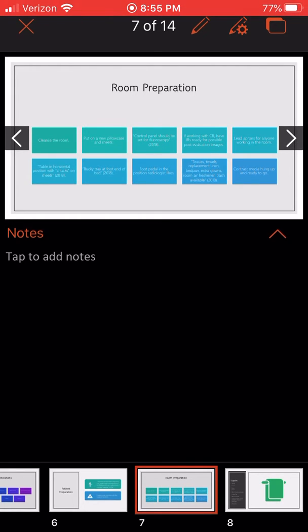The table should be in a horizontal position with chucks on top of the sheets in case of pre-evacuation of the contrast media. The Bucky tray should also be at the foot end of the bed so it does not be in the way of the anatomy. The foot pedal should also be in a position that the radiologist wants so they can easily press on it during the procedure. Tissues, towels, replacement linen, bedpan, extra gowns, room air freshener, and trash cans should also be readily available in the room. Contrast media should be hung up and ready to go at the foot end of the bed.